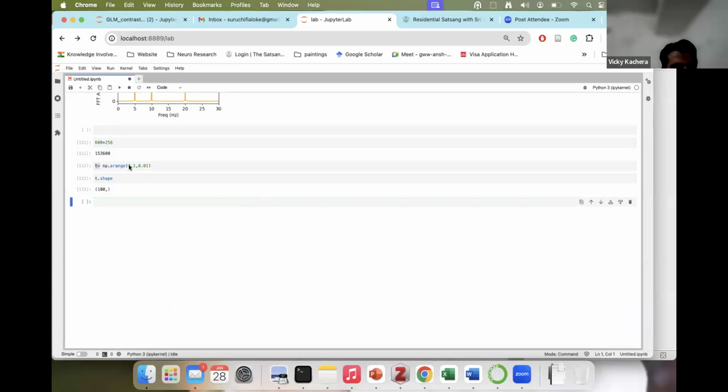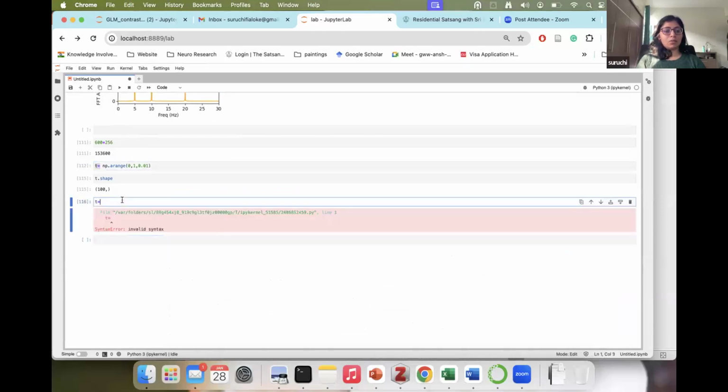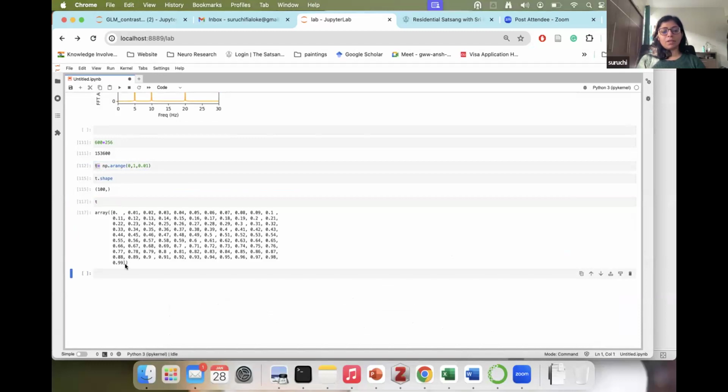So I'm saying if I took a measurement at all these points between 0 and 1 seconds, I will take one data measurement each. The amplifier will take a measurement at 0 seconds, 0.01 seconds, 0.02 seconds, and so on, up until 1 second. So my sampling rate becomes 100. So in time, you have data for all of these points, and then you have something like a signal.